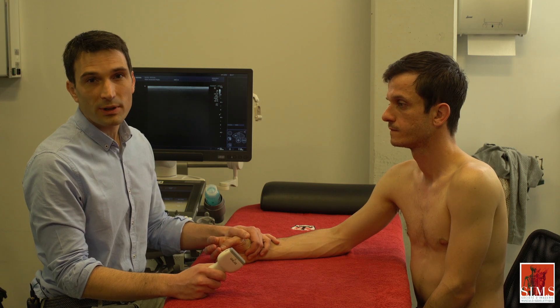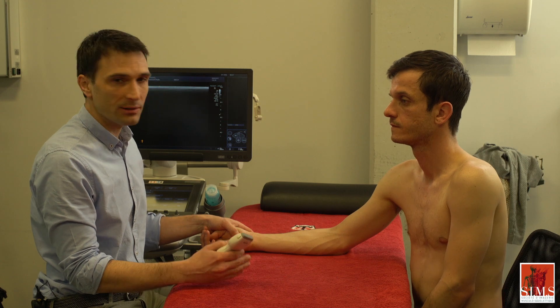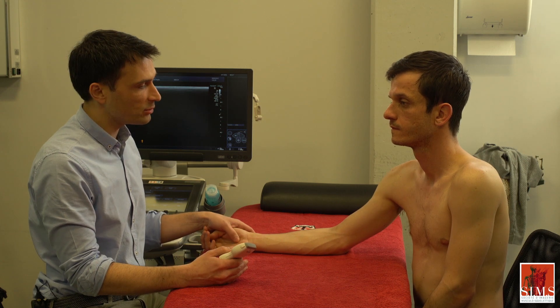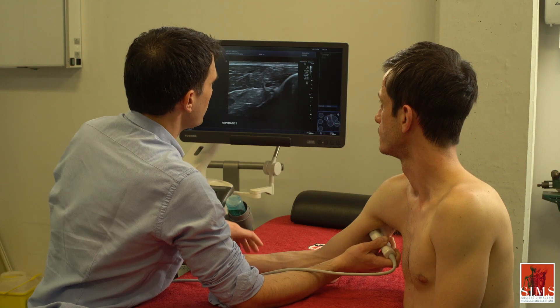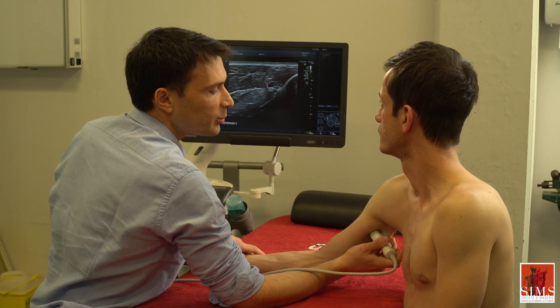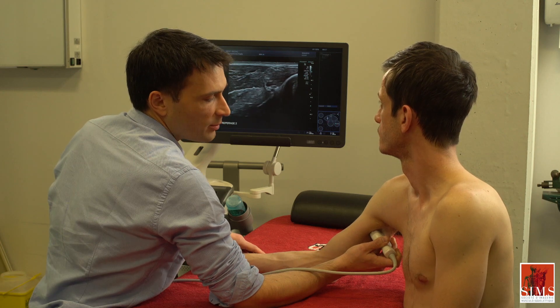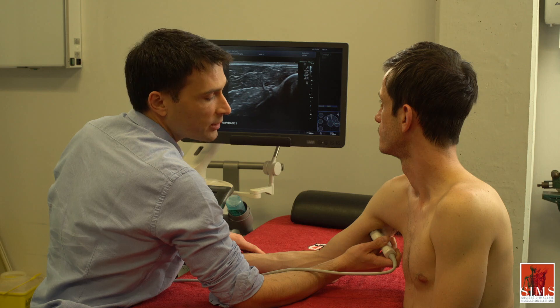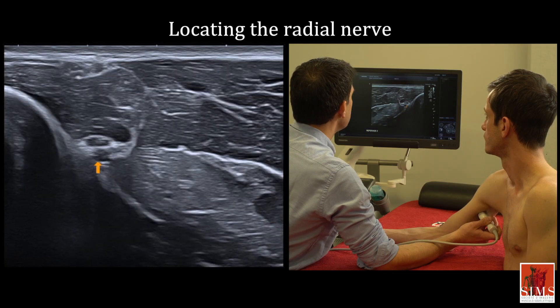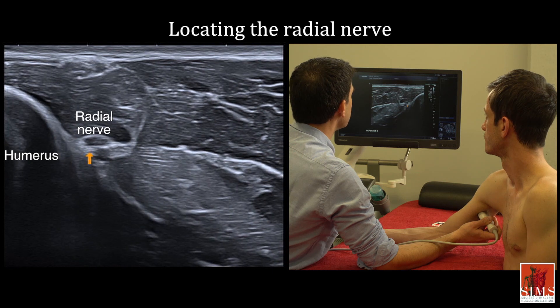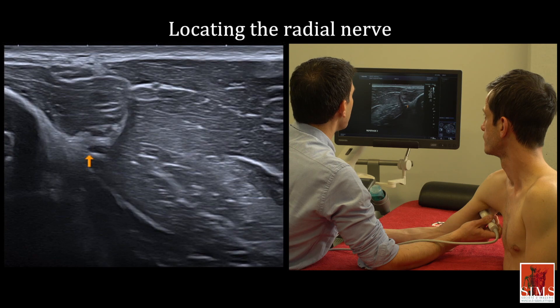To examine the radial nerve from the axilla to the wrist, the patient is placed in a seated position with the arm resting on a support for good stability and mobility during the examination. To start, the radial nerve is easy to locate on the medial surface of the arm with the upper limb positioned in abduction and external rotation. It is located in direct contact with the cortex of the humeral shaft, accompanied by the deep brachial artery.